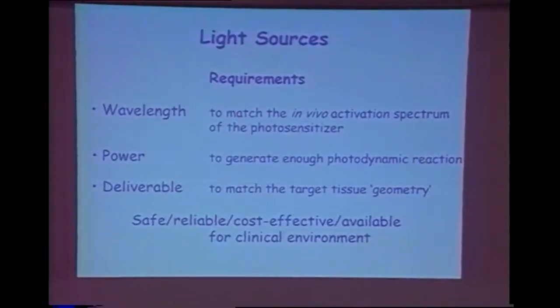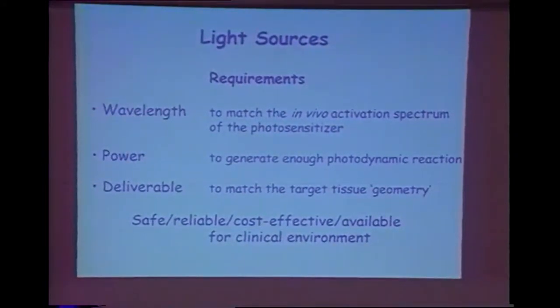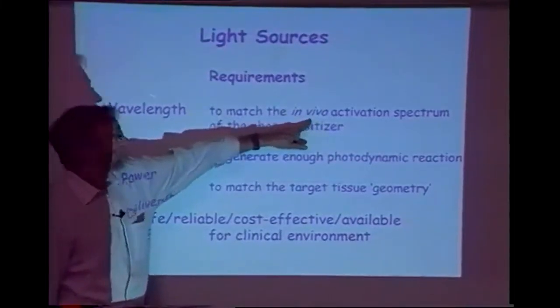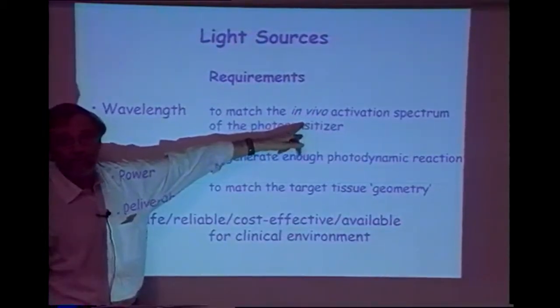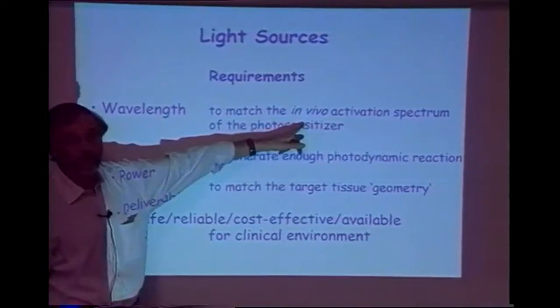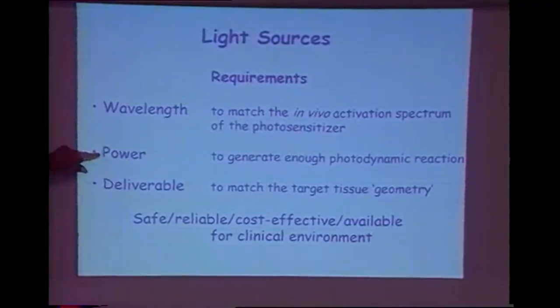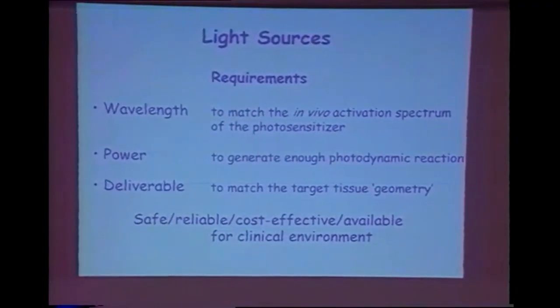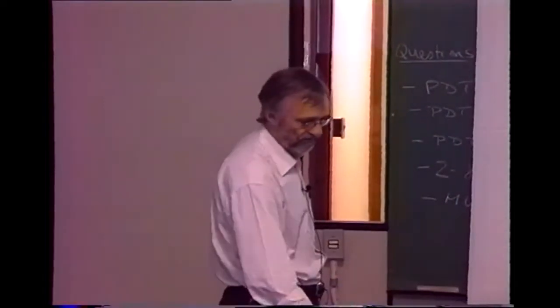As we saw yesterday, you need the wavelength to match the activation spectrum of the photosensitizer. Be a little careful here, because for some photosensitizers, the action spectrum in vivo is not the same as the absorption spectrum in solution. So you have to check that. You need enough power to generate the reaction, the light has to be deliverable, and it has to be safe, reliable, cost-effective, available, and work in the clinical environment, etc. So all those practical issues.